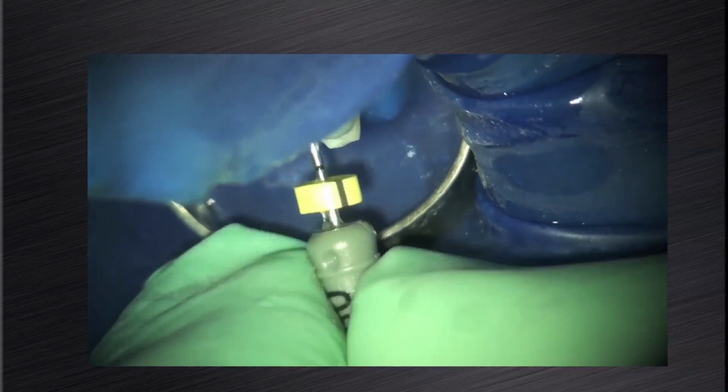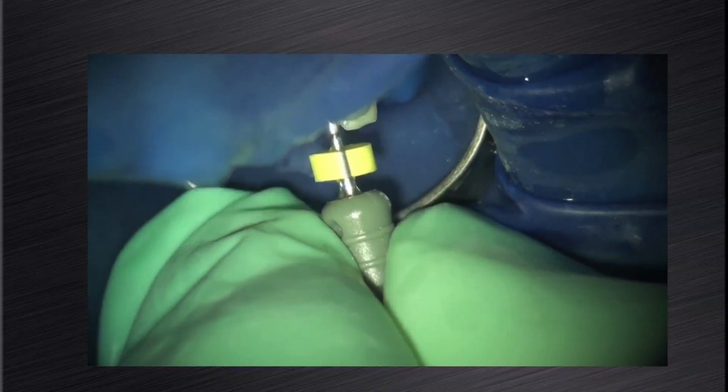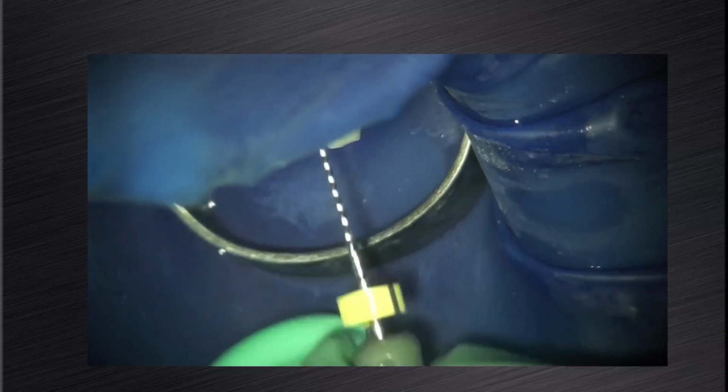On this video we have a size 08K file that can travel down the root canal to patency. However, when we pull the file back out of the canal and try to push it back to working length, it hangs up somewhere on the canal wall. This means that there is a glide path, but it is not reproducible.